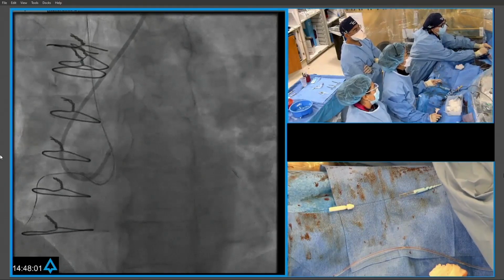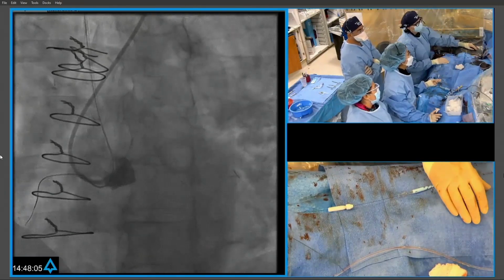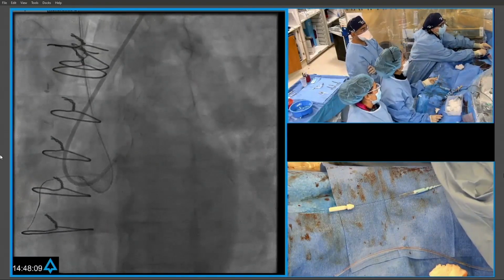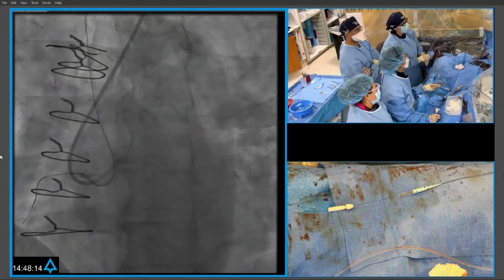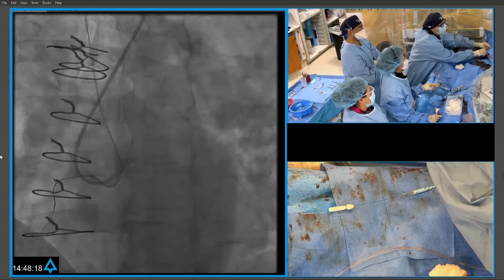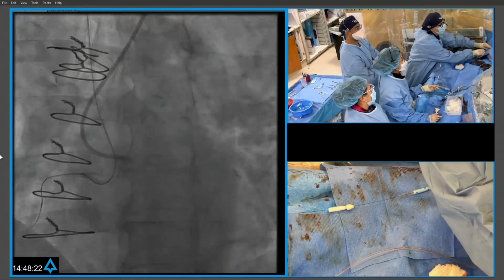So the story here is that we made progress and then stopped at that point. What we ended up doing is trying to take a dual, but for whatever reason, as can sometimes happen during the case, the distal collaterals from the apex were less visible, so we can't really see our distal vessel. So again, exactly as was said in the prior case, you don't want to perseverate too long.